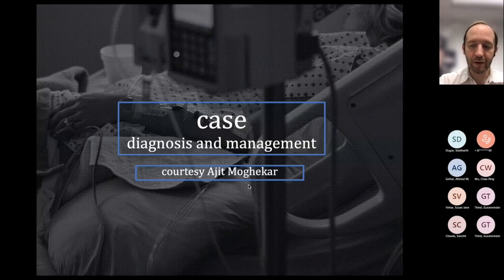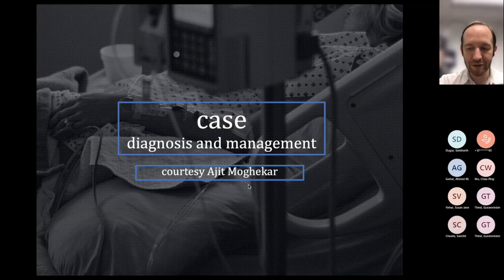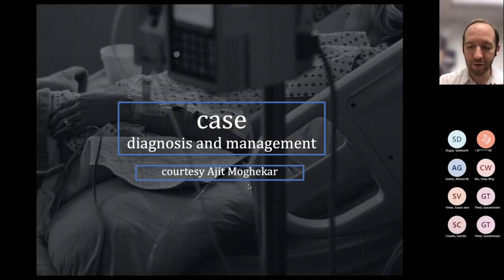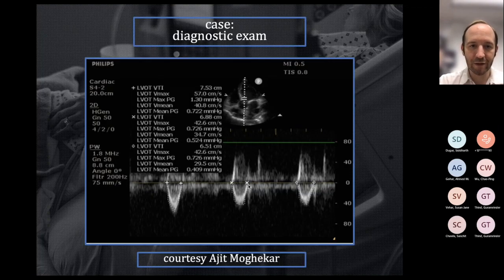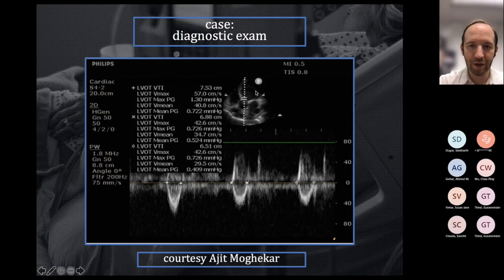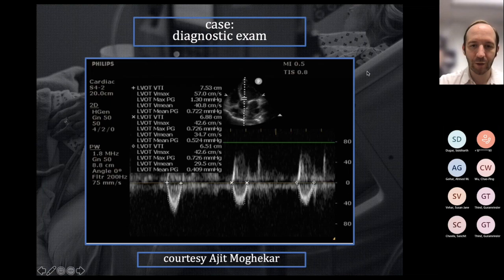Now I'll borrow a case from Dr. Mogokar as a neat illustration of how you might use this value both diagnostically and for treatment. This is a 60-something-year-old lady who came to the ICU with severe circulatory shock of uncertain etiology. A bedside echo showed a dilated LV cavity and decreased systolic function. LVOT VTI measurements were obtained: 7.5, 6.8, and 6.5 — totally abysmal, about a third of normal. The pulse wave gate was right where you'd want it, on axis, with a beautiful image — so this is probably reliable information, consistent with cardiogenic shock.